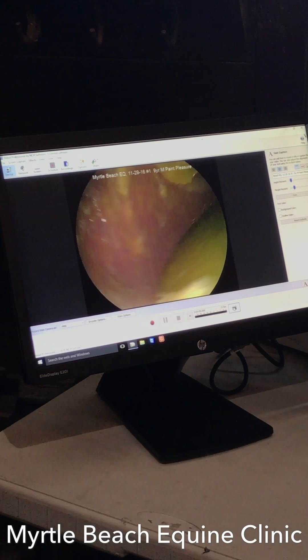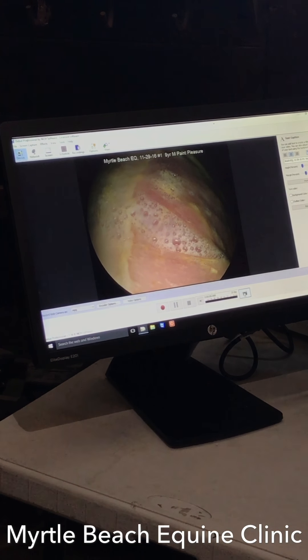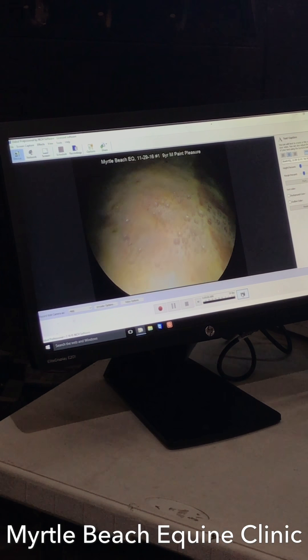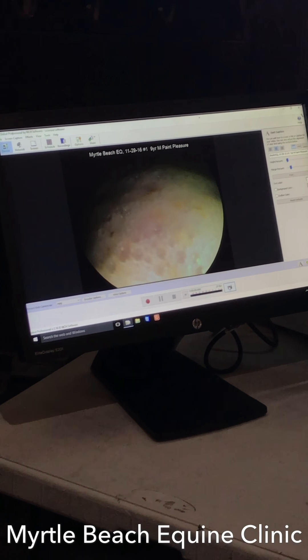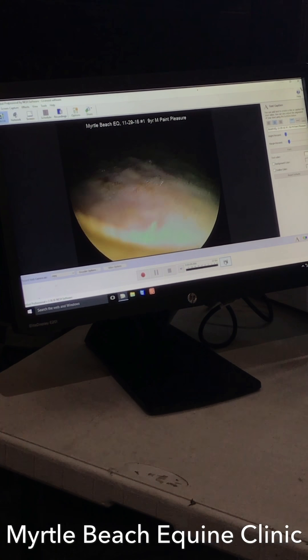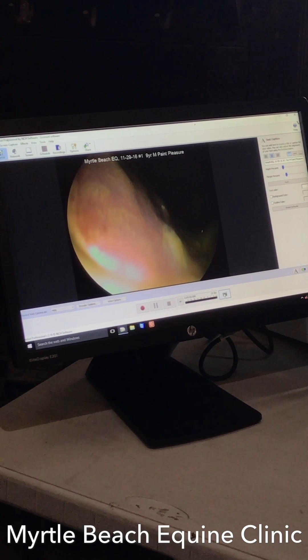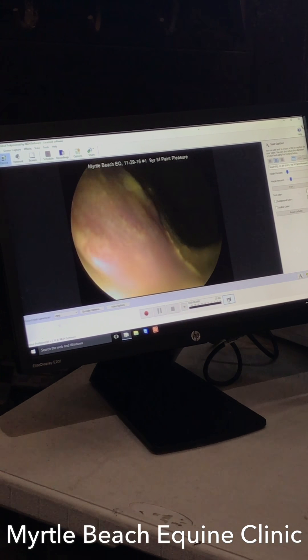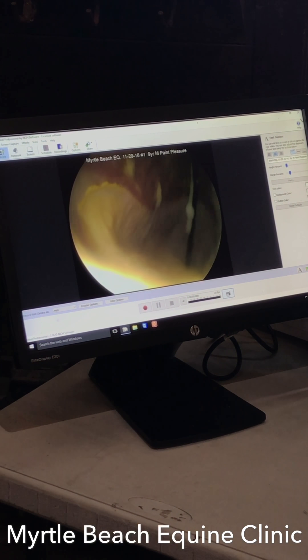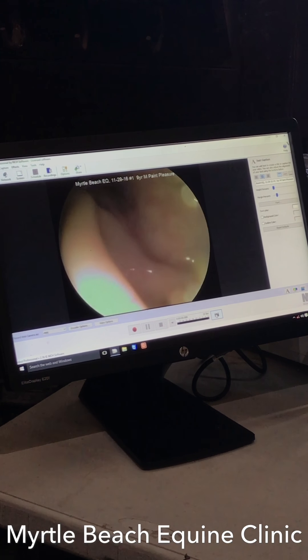We're going to go ahead and look down here. I'm going to ride this margo all the way around. Go ahead and advance it, just keep going in. I'm going to try and stay on the top side of this. We're sliding down and making a circle. Let me see where I'm at — there we are at the pylorus shelf.